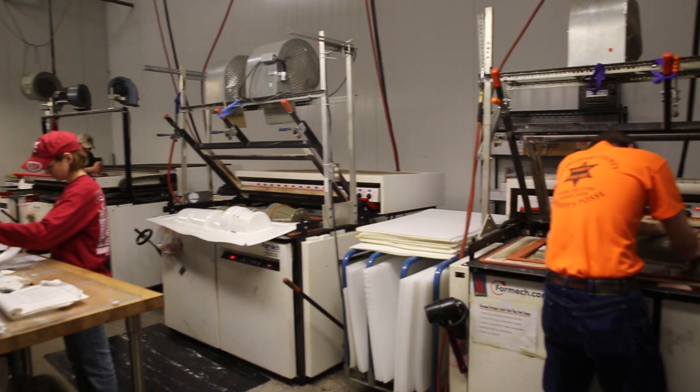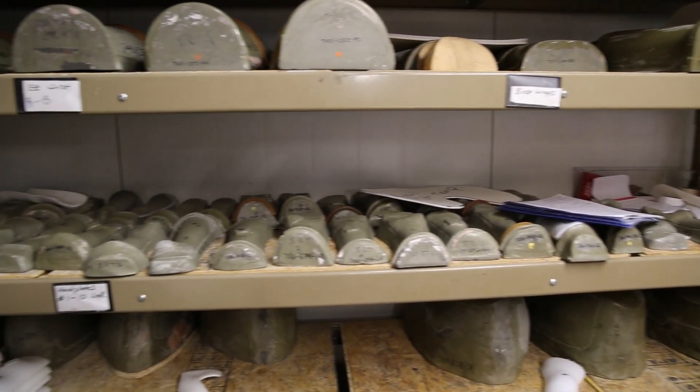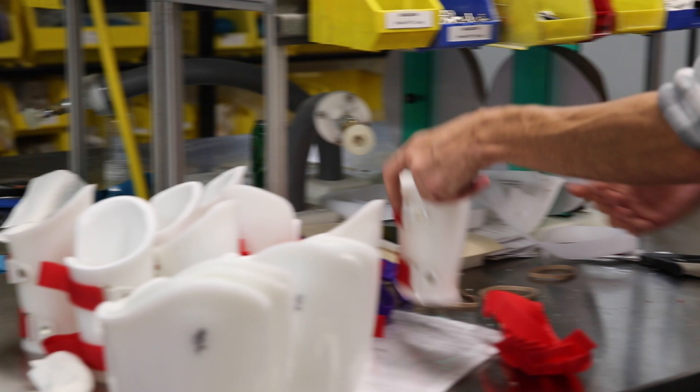My name is Glenn Phillips. I'm the design engineer at Joint Active Systems. Joint Active Systems was developed by Dr. Peter Benuti. What Joint Active Systems does is it develops devices for range of motion of the body.